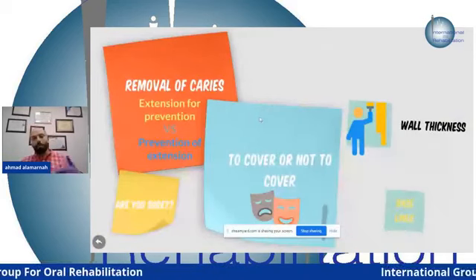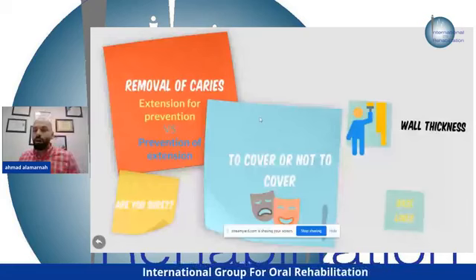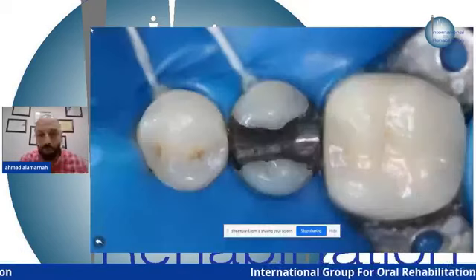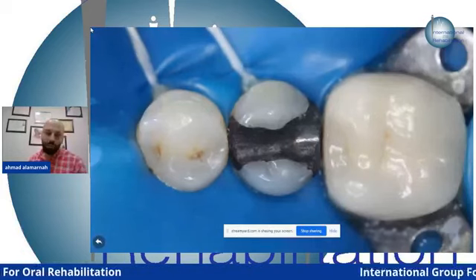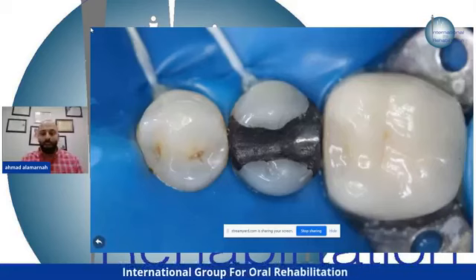After that, when you do your preparation, you have to be aware about the wall thickness. What do we mean by wall thickness? Let's see this picture. In the first picture here, we have an MOD amalgam restoration. The patient came to me and wanted to remove it and replace it with a more aesthetic one.